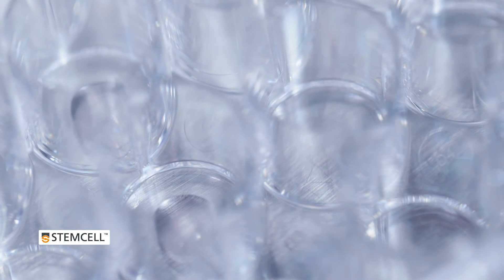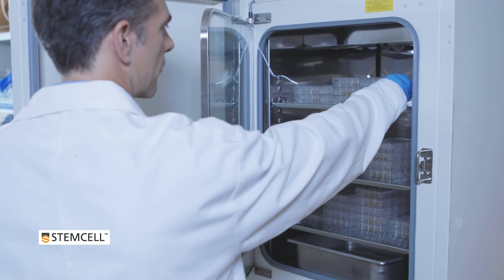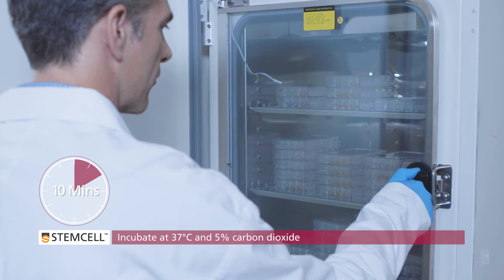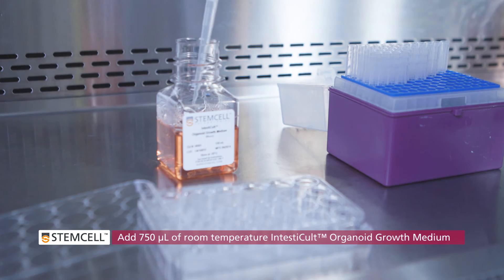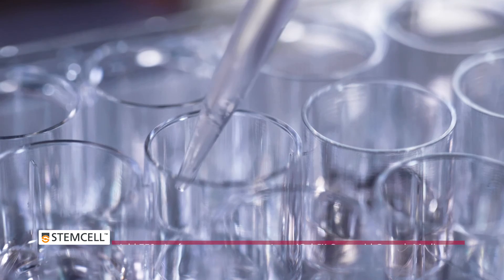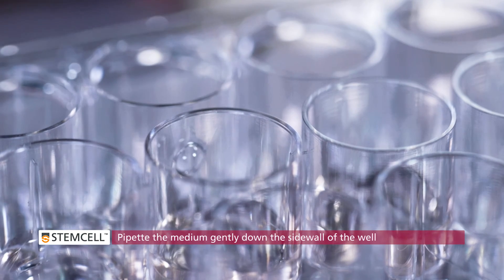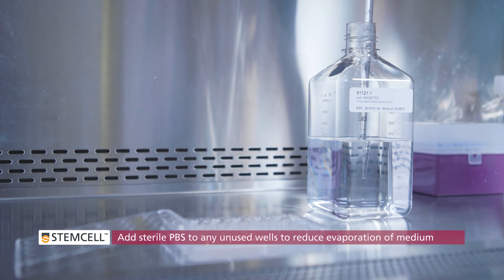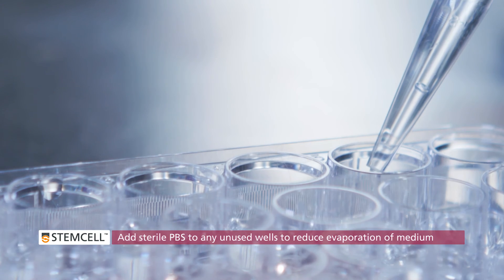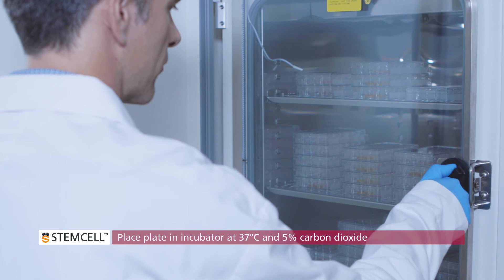The samples should form domes in the middle of each well. Being careful not to disturb the matrigel domes, place the plate in an incubator at 37 degrees Celsius. Incubate for 10 minutes to set the matrigel. Add 750 microliters of room temperature intesticult organoid growth medium to each well by pipetting the medium gently down the sidewall of the well. Be careful not to pipette the medium directly onto the domed cultures. Add sterile PBS to any unused wells to reduce evaporation of medium from the plate during culture. Place the lid on the culture plate and incubate at 37 degrees Celsius and 5% carbon dioxide.